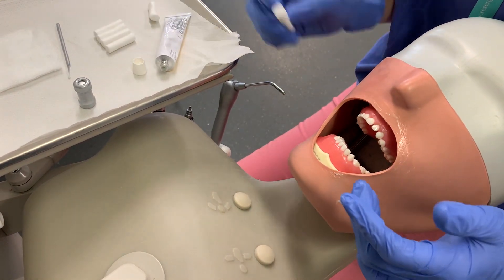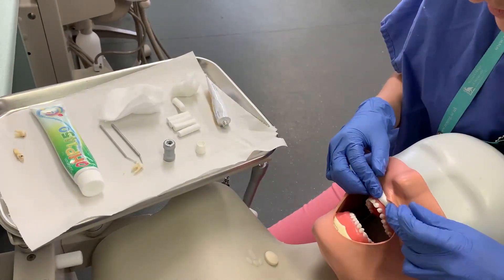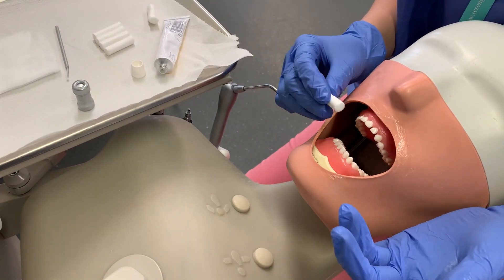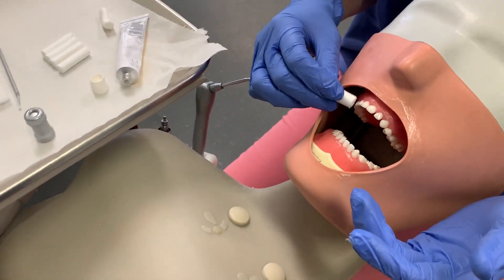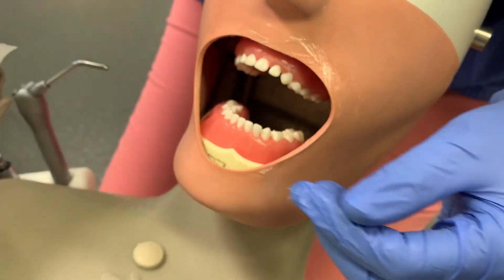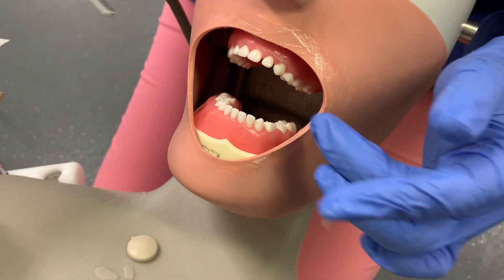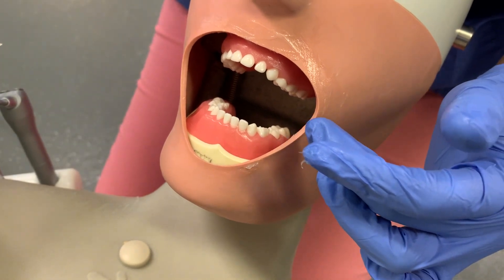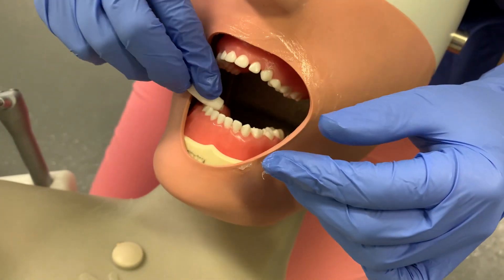Once you've got all your Vaseline on there, just add a cotton roll as well before you start to apply it. The next step is you want the teeth to be as clean and dry as possible. You don't need to remove caries, but if you're removing any debris like bits of food or some really soft caries, you might want to do that with an excavator. Then if you're able, just dry them with a three-in-one, and if not, just a bit of cotton wool roll.